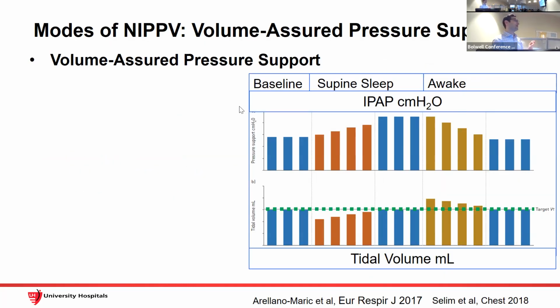When I say VAPs, there are different types, right? There's AVAPs, IVAPs. What you do is you set it. So step back. Ventilators themselves have 3 different modes. One is you hit a certain pressure, but depending upon the compliance of your chest wall and your lungs or your upper airway, you're just going to get to that pressure, and that pressure is all you get.